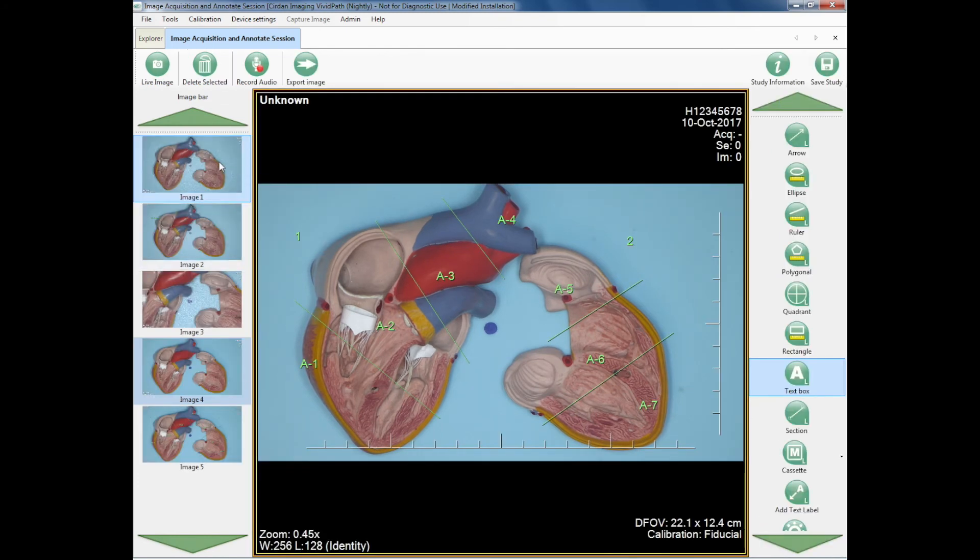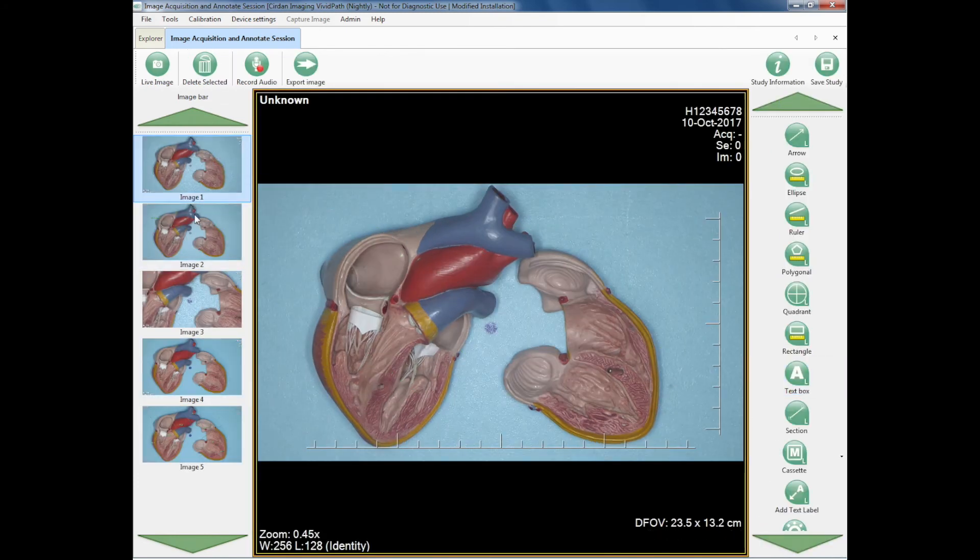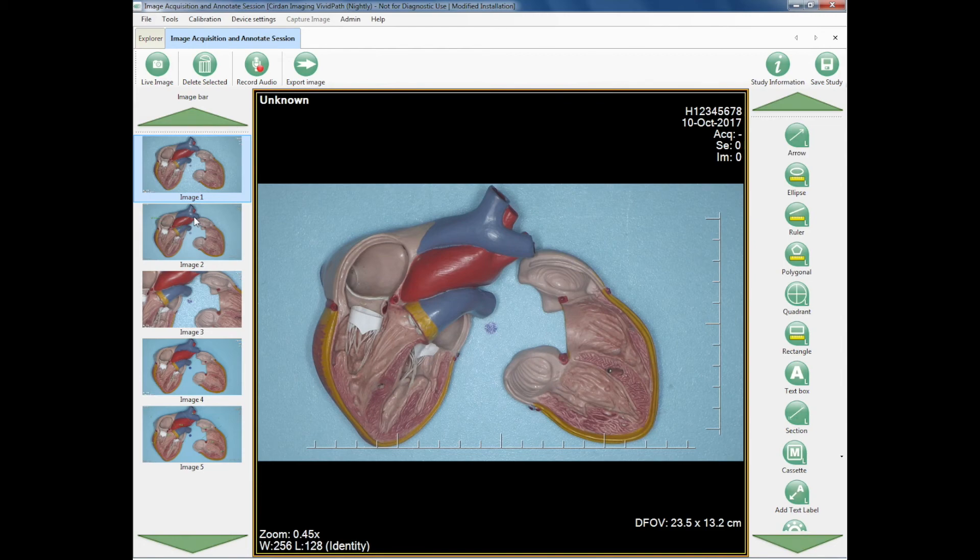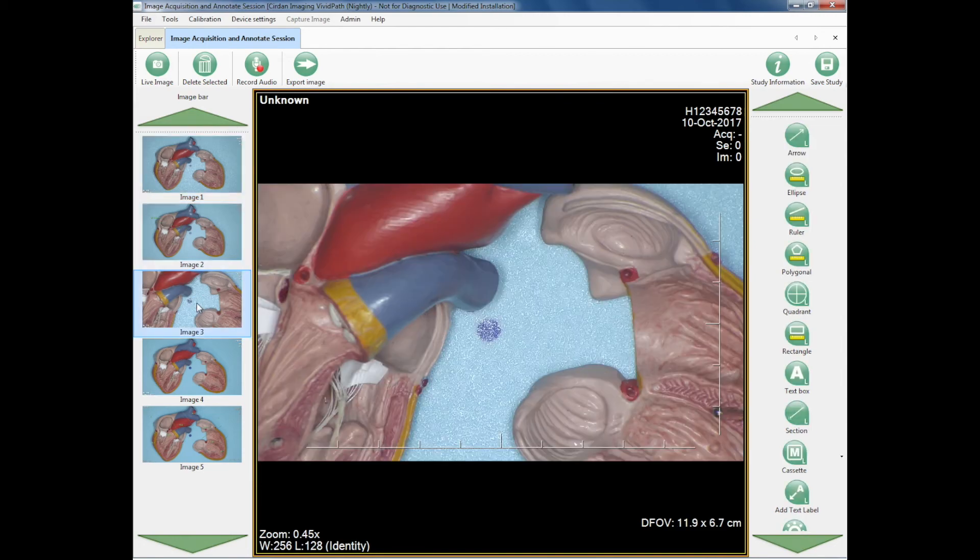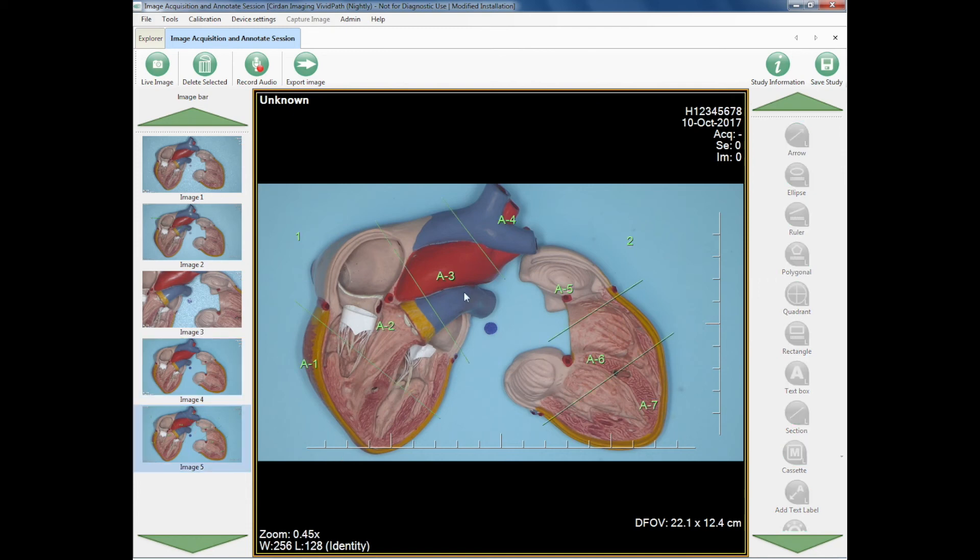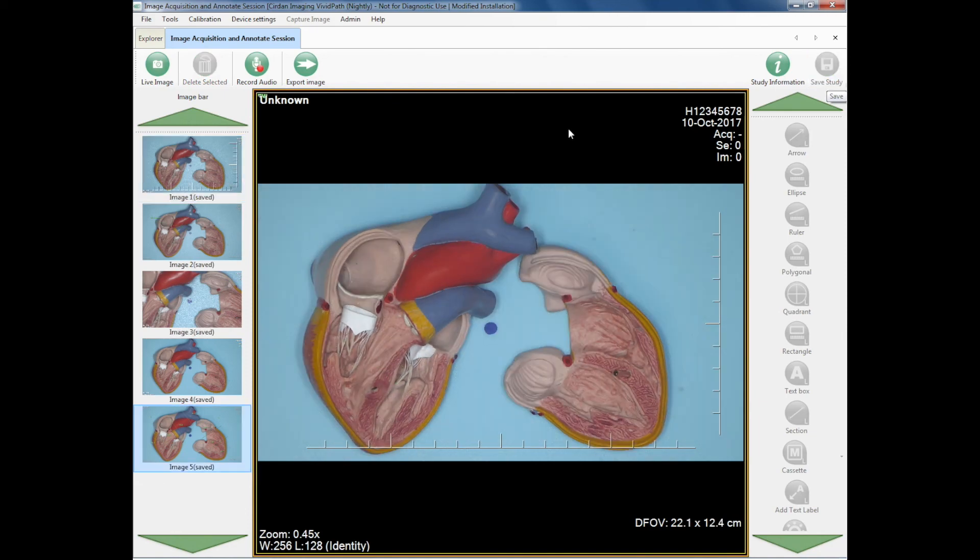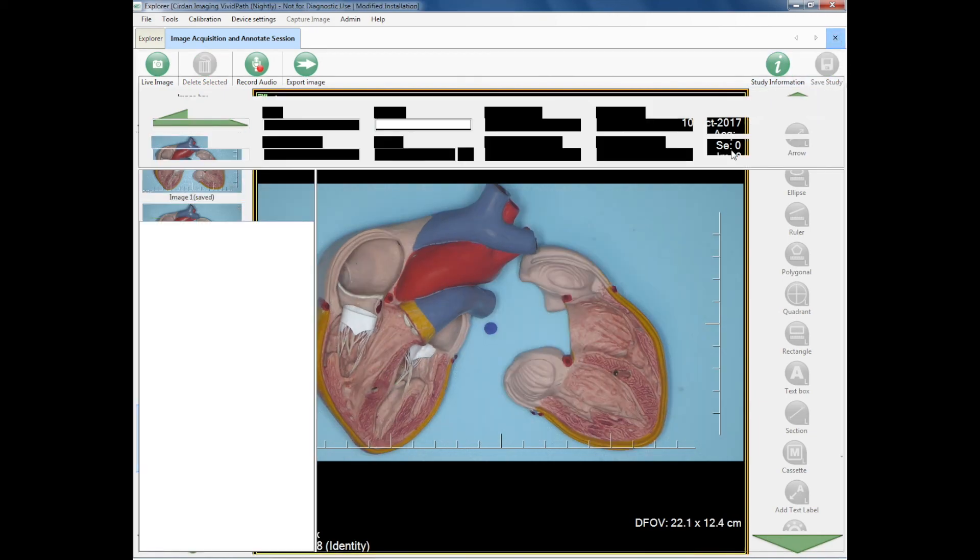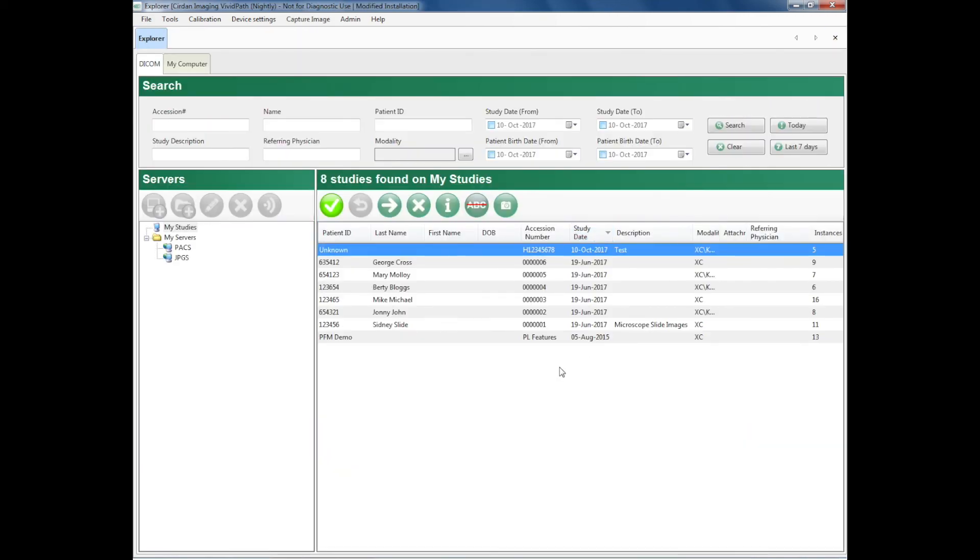So I've got the original, I've got the annotated original, I've got another original, a third original, and an annotated image. I save the study, and we're done. It's as simple as that.